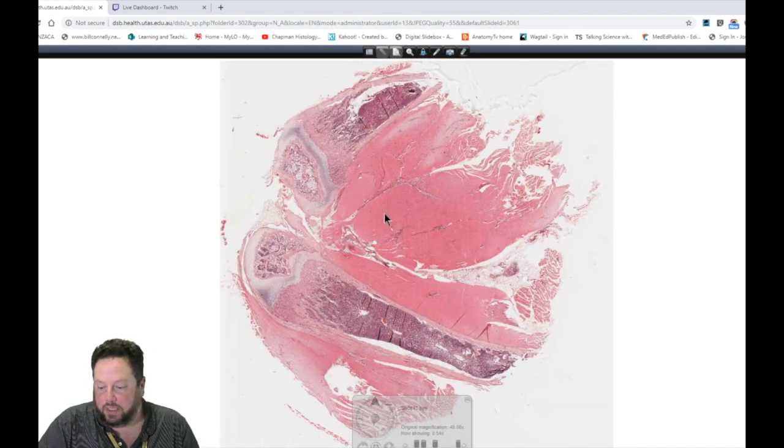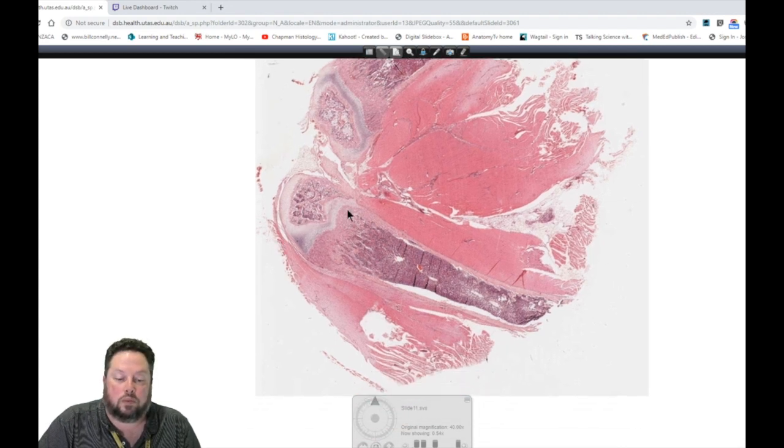All right, I can see we're running out of time. We've only got a few minutes left. So again, this is another section. I think we might skip past it.